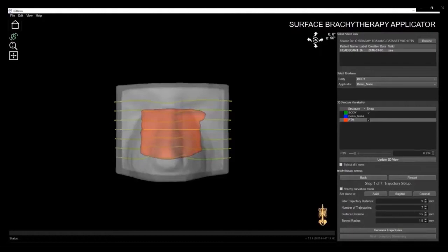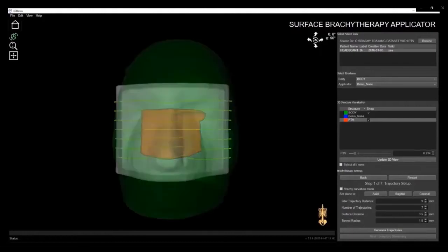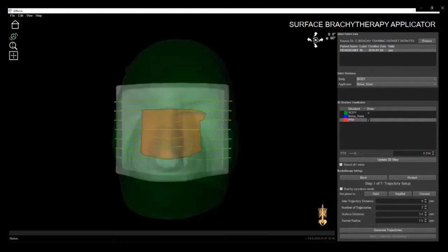Now, you can see the body and the PTV, along with the brachy applicator and the corresponding catheter trajectories. This feature was added as a direct result of customer feedback and served to provide another level of confidence when creating applicators in our software.